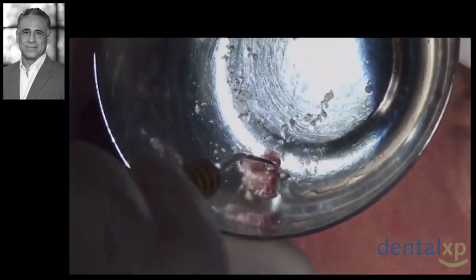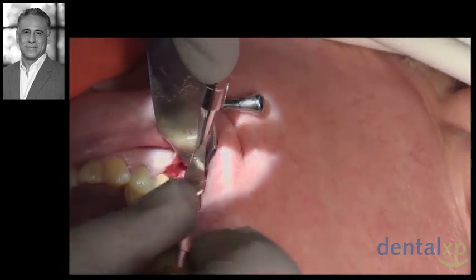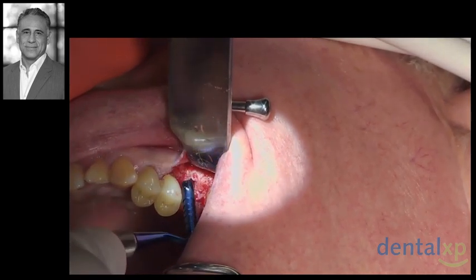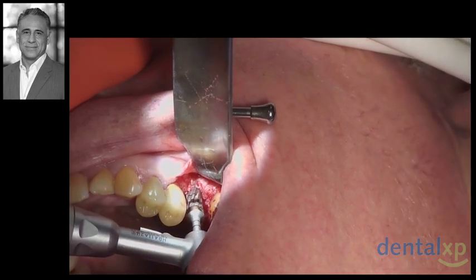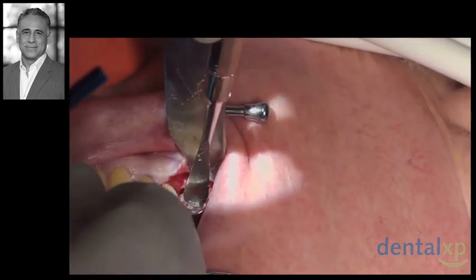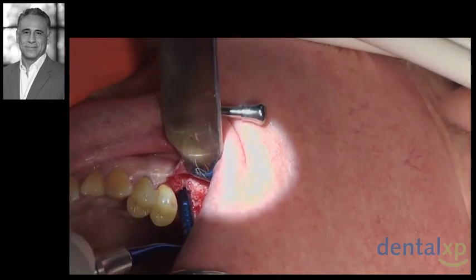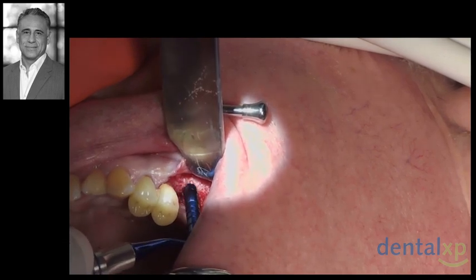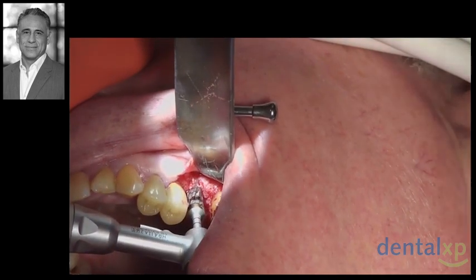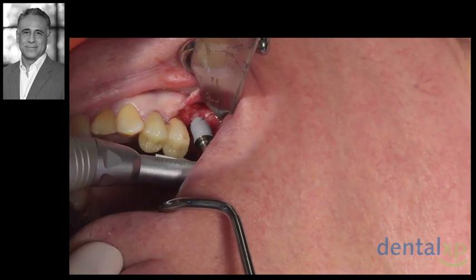Next, we'll place mineralized freeze-dried bone in the osteotomy site and push it toward the apical aspect of the osteotomy using a bone plugger. Then we'll use the last osseodensification burr at about 800 to 1000 RPM in reverse mode to drive and compact that bone more apically and laterally. And this can be repeated again with additional amounts of bone graft until sufficient augmentation and lift has been accomplished. Next, we'll place the implant.